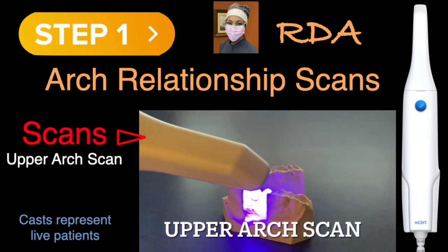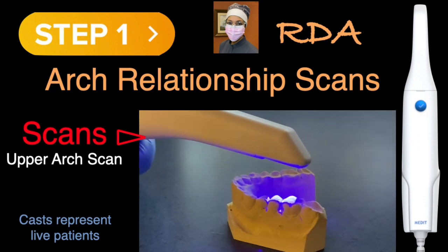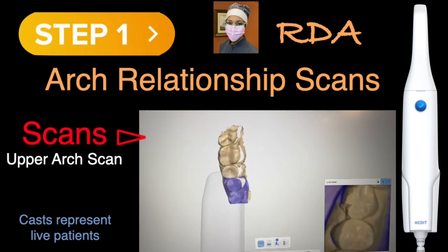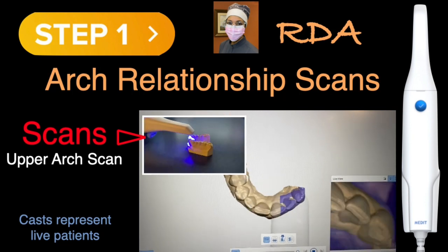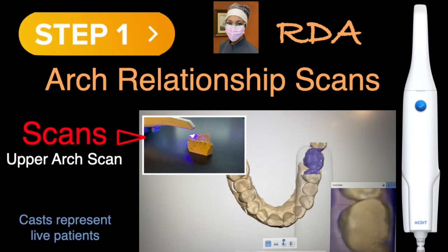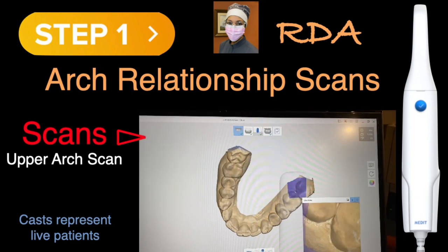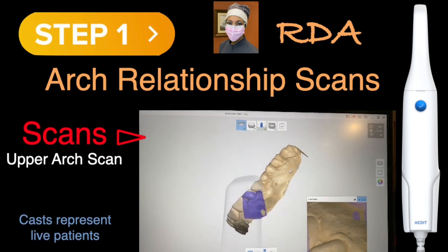So for the upper arch, we have the patient open their mouth, we go in with the scanner and start from the posterior and work to the anterior, rocking it in the anterior area to pick up a little bit of the facial and lingual. As we do this, we're going to get a nice impression of the maxilla. And so we usually start in a sequence, which means we're going to start on the upper.